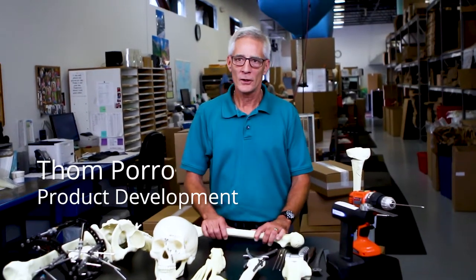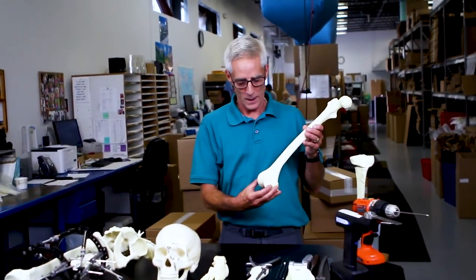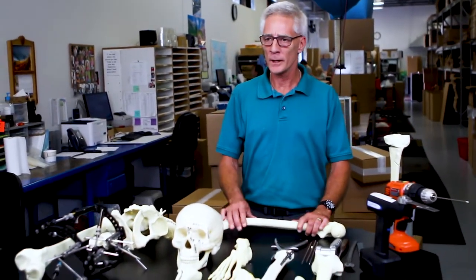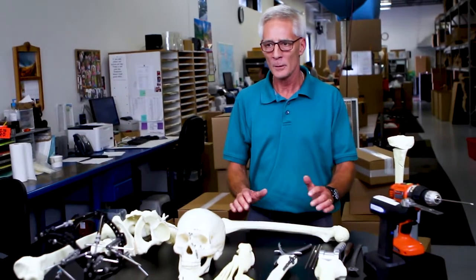Hello, my name is Tom. Today we're going to talk about the Sawbones Solid Foam product line — our flagship product that we produced over 40 years ago. We produced this to fill the need of the resident surgery training programs that had no anatomical models in which they could actually practice basic skills.